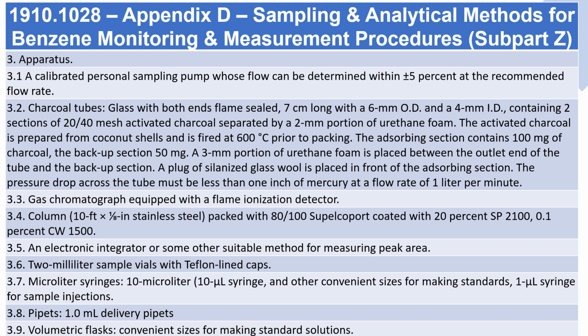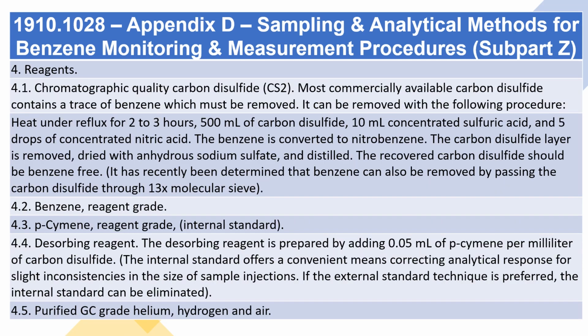3.6. 2 ml sample vials with Teflon-lined caps. 3.7. Microliter syringes, 10 microliter, and other convenient sizes for making standards, 1 microliter syringe for sample injections. 3.8. Pipettes, 1 ml delivery pipettes. 3.9. Volumetric flasks, convenient sizes for making standard solutions. 4. Reagents.